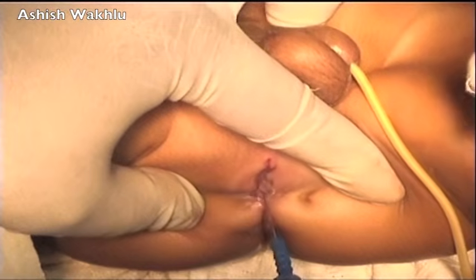In such cases, it is sometimes difficult to distinguish the correct place where the neoanus should go, and in such cases, it is useful to remember that the horizontal line joining the most prominent point of the two ischial tuberosities should cross through the center of the anal opening or immediately in front of it. And using that landmark, we made our incision.